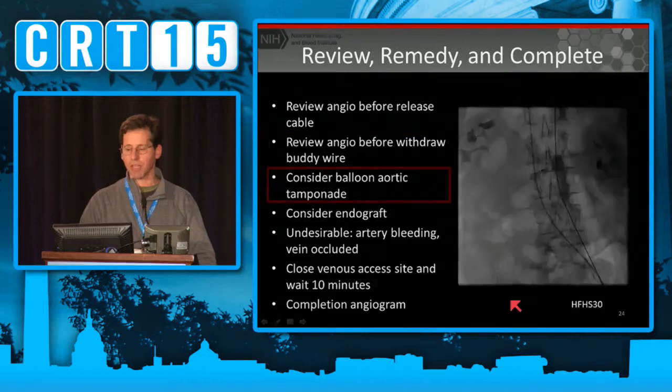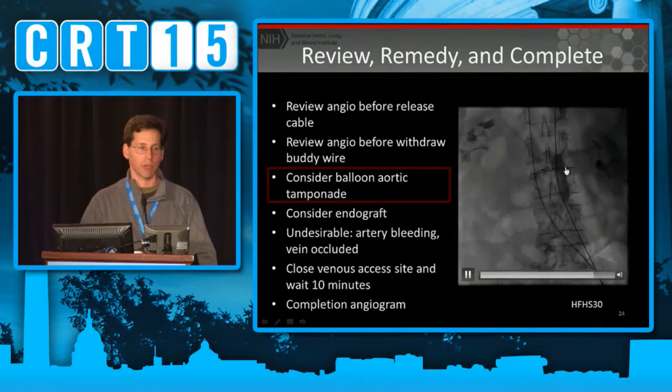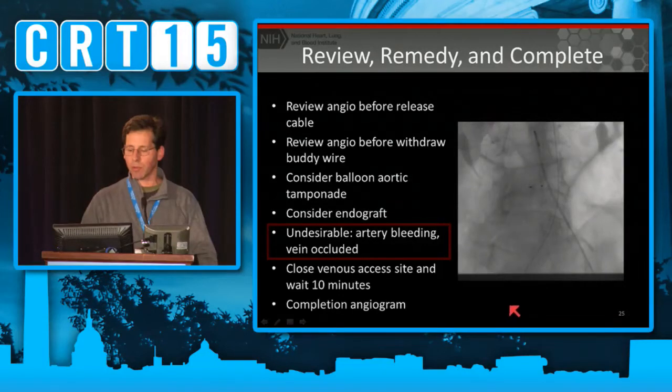And the most common trick, in case there was a little bit of extravasation, is just to take a balloon. Often these aortas are very small because the typical patient requiring aortic caval access is a woman with small vascular access, and usually a 14 millimeter Fox cross will work just fine. Occlude that for 5 minutes or so in a heparin reverse patient, and that will usually solve all problems. You decide whether an endograft is necessary.